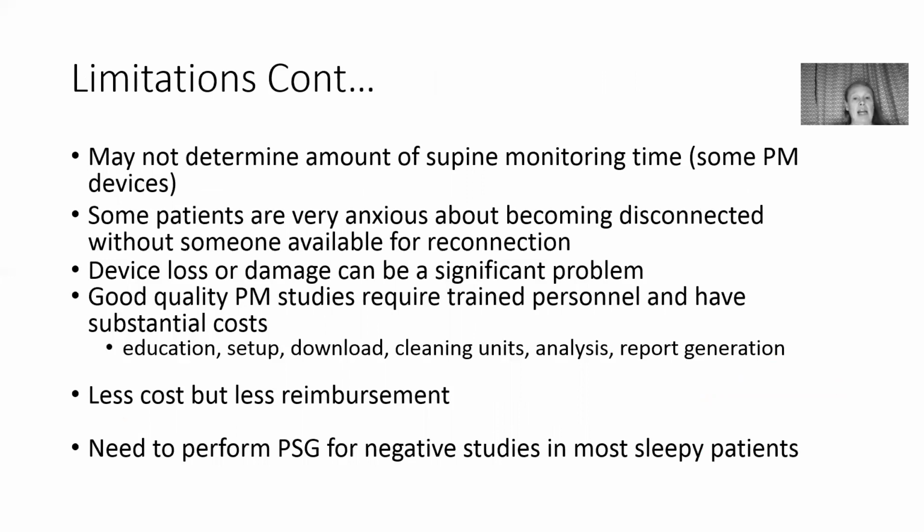Some patients are very anxious about becoming disconnected without someone available for reconnection, so they may not sleep well because they're kind of worried about that. There can be device loss or damage, which then you end up eating the costs at your sleep facility. Good quality home studies require trained personnel, and they do have substantial costs.